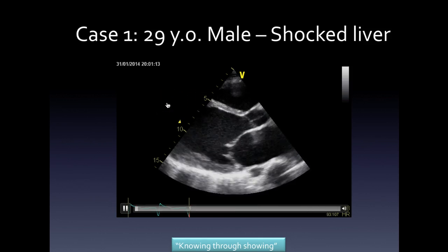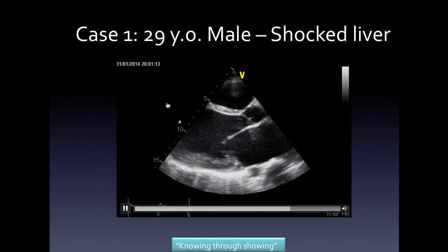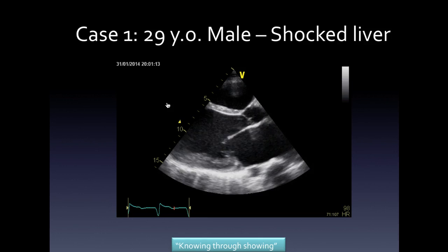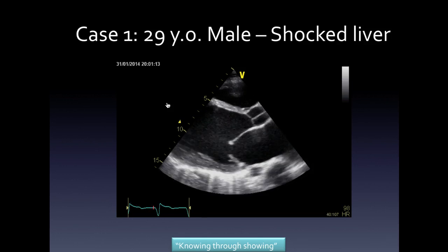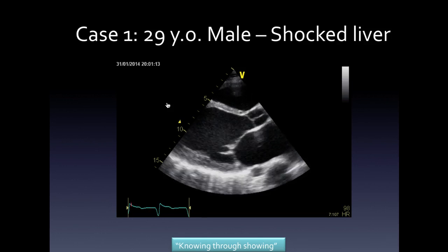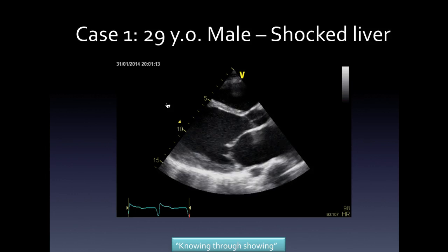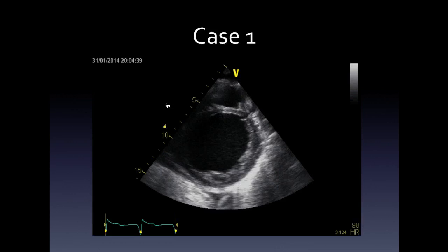So what's the ejection fraction? You can't answer the question because you don't have enough information. This is one view. You can eyeball it and say, it's not good. Now, that could be very useful in a quick setting. Whether the ejection fraction here is 22.3897% or 34, it doesn't matter. This is not a good heart. And I'd argue to you, you've already answered a lot of your questions before you go any further. But let's take another view.